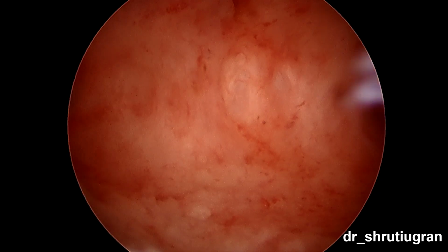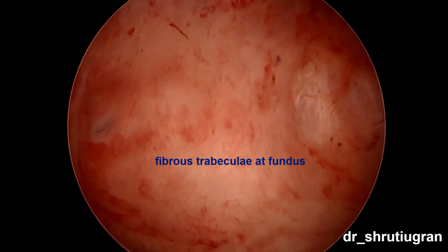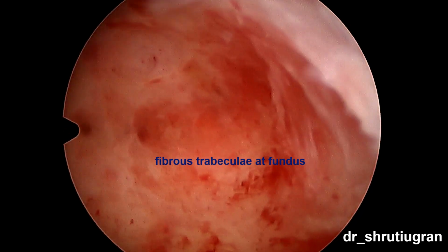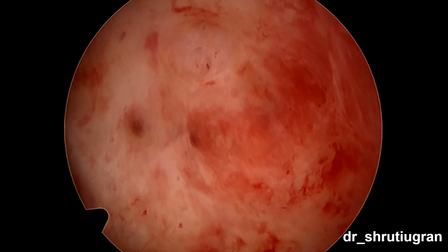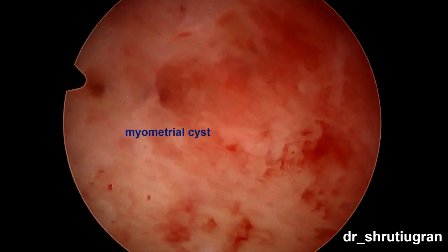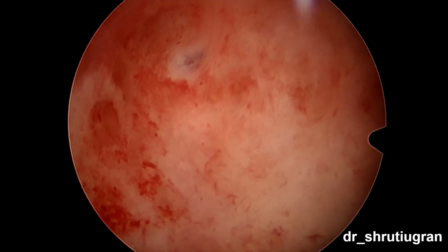This hysteroscopy shows features that are suggestive of adenomyosis but are not pathognomonic of adenomyosis. Here we can see the fundus of the uterus, which shows multiple fibrous trabeculae in the fundal area, which is not normal, and this is one of the features suggestive of adenomyosis. Also, as we see further, we can see 2 brown spots over here, which are suggestive of myometrial cysts. These are formed because of ectopic islands of endometrial tissue, and they form into a cyst whenever they secrete. So probably these were subendometrial and small and were not diagnosed on ultrasound.